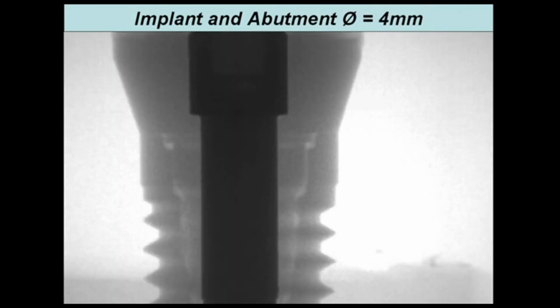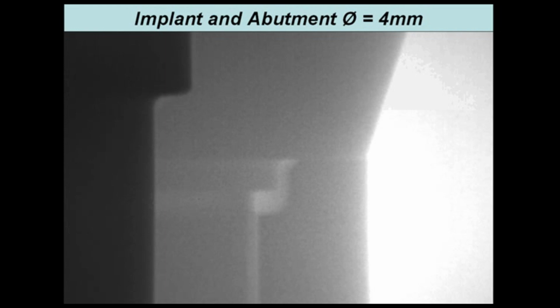If we compare this with a 4mm implant, it's clear to see that the micro gap increases, and in the enlargement we can see a really large micro gap.